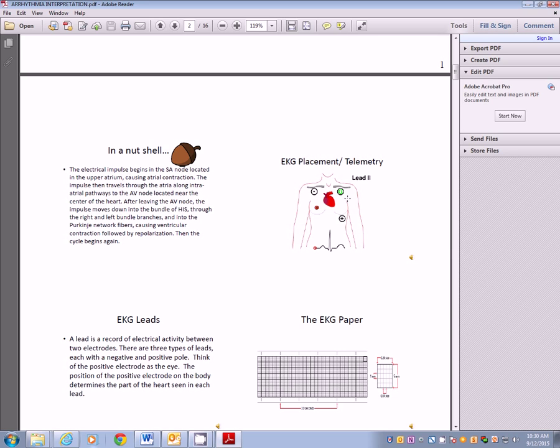So for a lead 2 setup, a popular phrase is white to right, red to ribs, and black left over. Okay, so black's in the left, it's left over. So if it's black, green, or brown, it goes over the red.